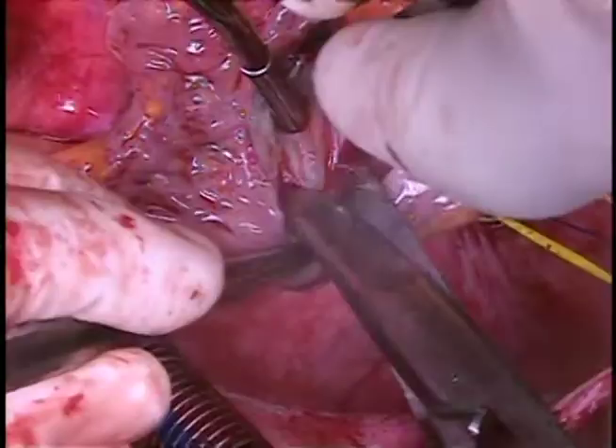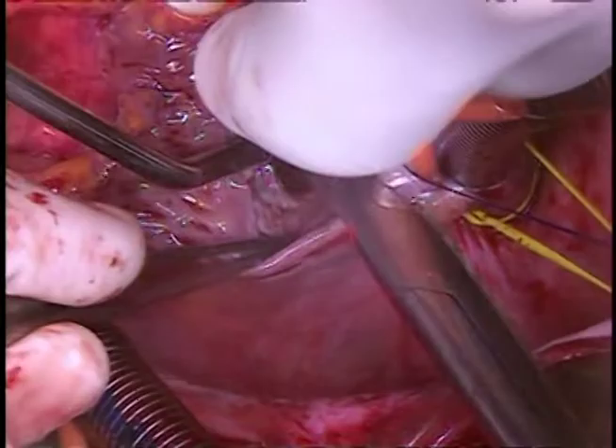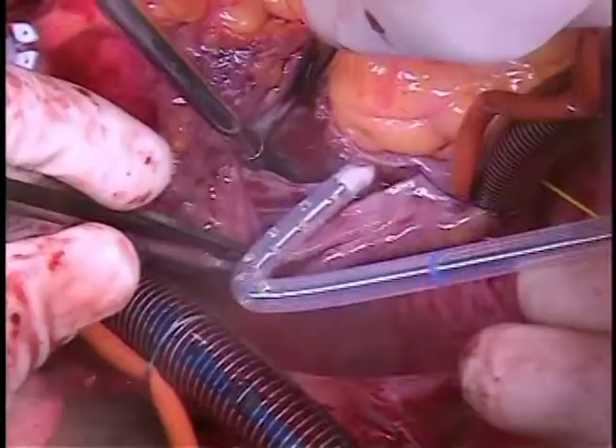Remember that a small minority may require a second arrest interval to replace or repair the valve. We also place an LV vent to improve visualization. In this particular case, the LV vent went through a PFO, which we had to repair.